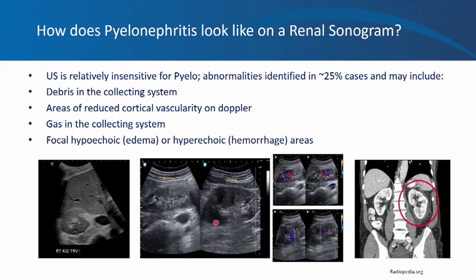Another ultrasound shows the right kidney appearing normal while the left kidney is bulky and hypoechoic. On color Doppler, cortical vascularity is decreased in the left kidney compared to the right, where many colors are visible in the cortex. A CT scan image of pyelonephritis demonstrates perinephric stranding. Symmetric bilateral perinephric stranding is relatively common in elderly patients, but unilateral asymmetric stranding in a patient with a suggestive history is an important sign of renal inflammation or acute obstruction.